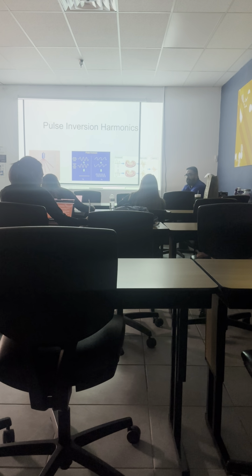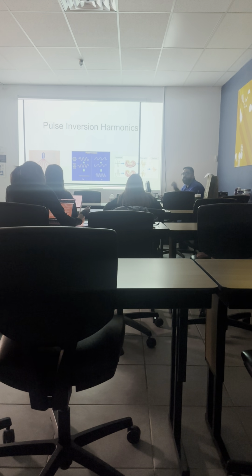Does that make sense? So the first ones cancel out, and then whatever's left goes. So let's not call it the first ones, let's call it the fundamental. Yes. The fundamental frequency, which is linear behavior, is canceled out, and we're left with the nonlinear behavior harmonics.